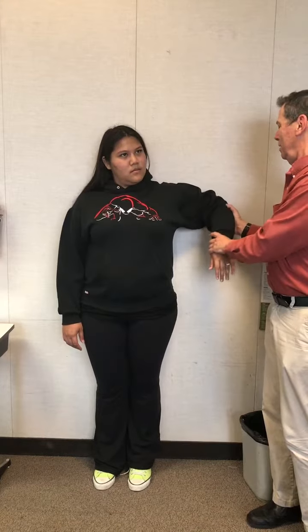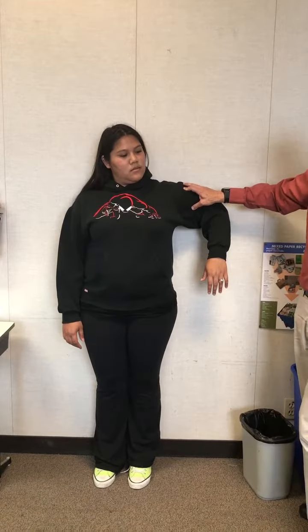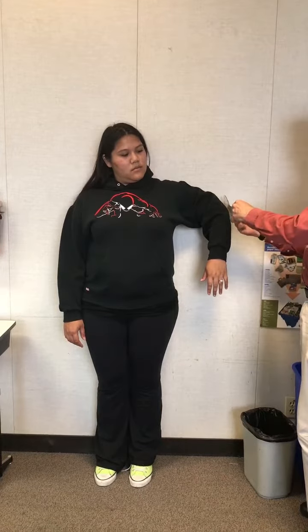From here to there — it's good to measure it. About 50 degrees. That's normal. It's normal for internal rotation to be less than external rotation.